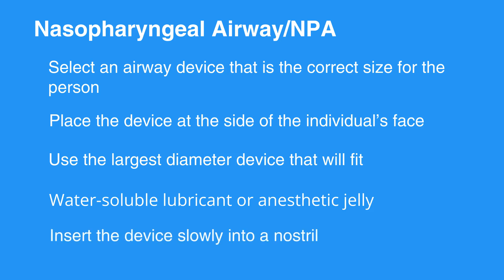Lubricate the airway with a water-soluble lubricant or anesthetic jelly. Insert the device slowly into a nostril, moving straight into the face, not toward the brain. It should feel snug; do not force the device into the nostril. If it feels stuck, remove it and try the other nostril.